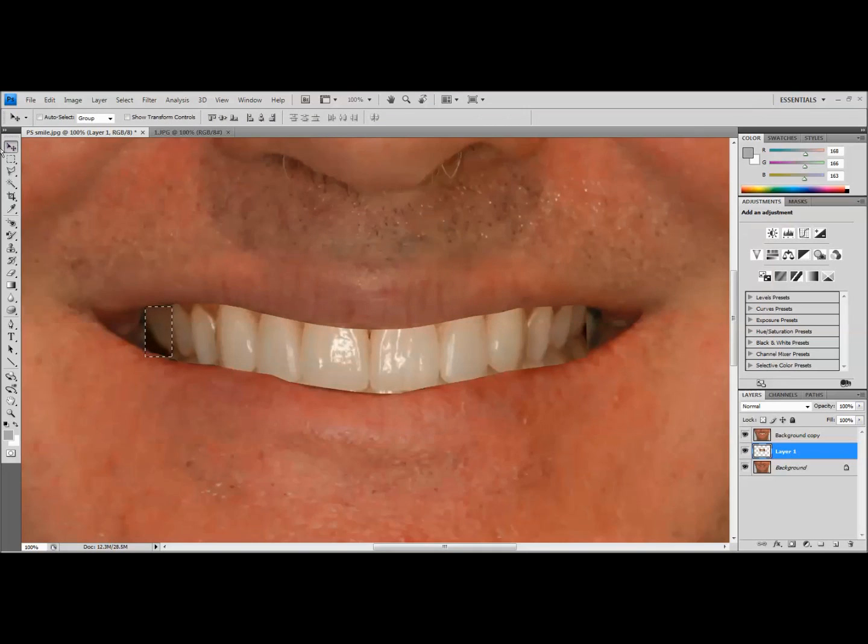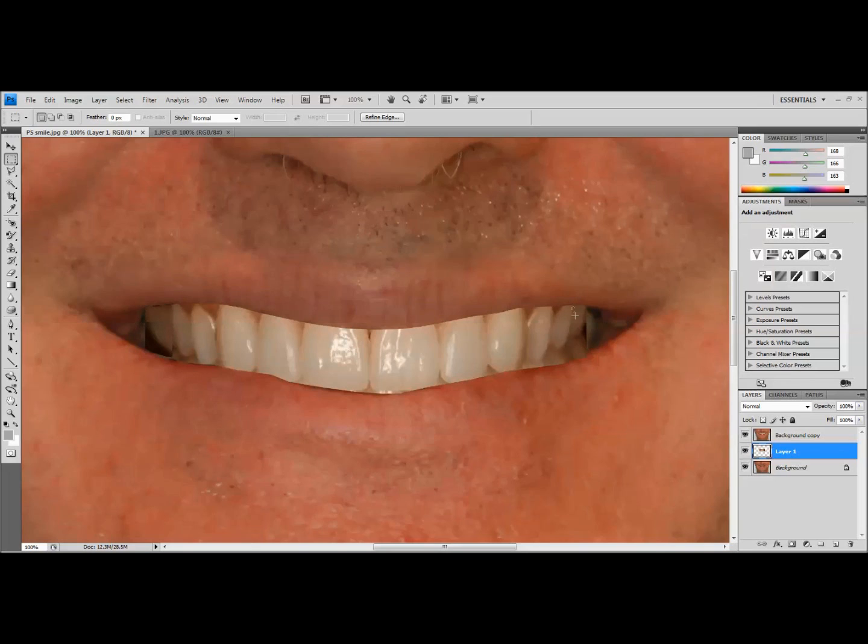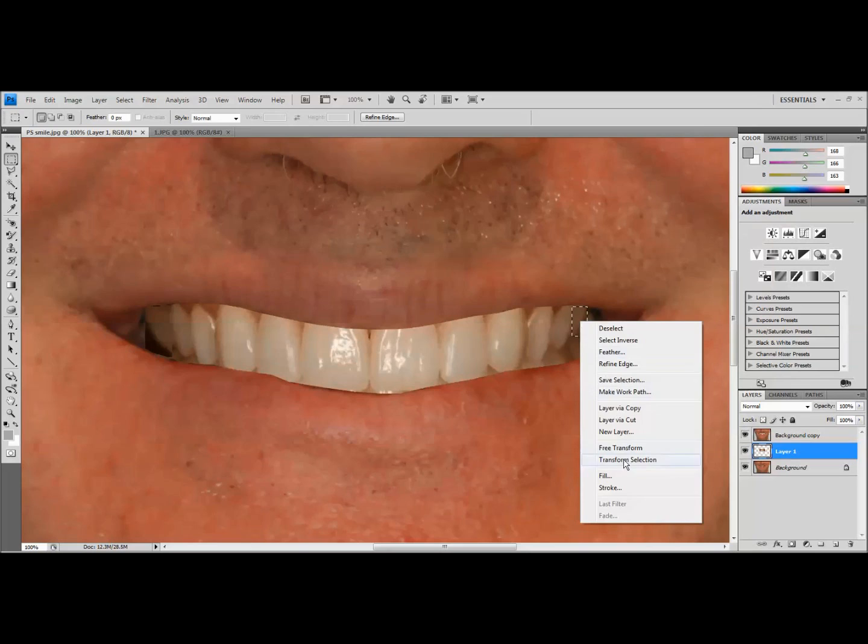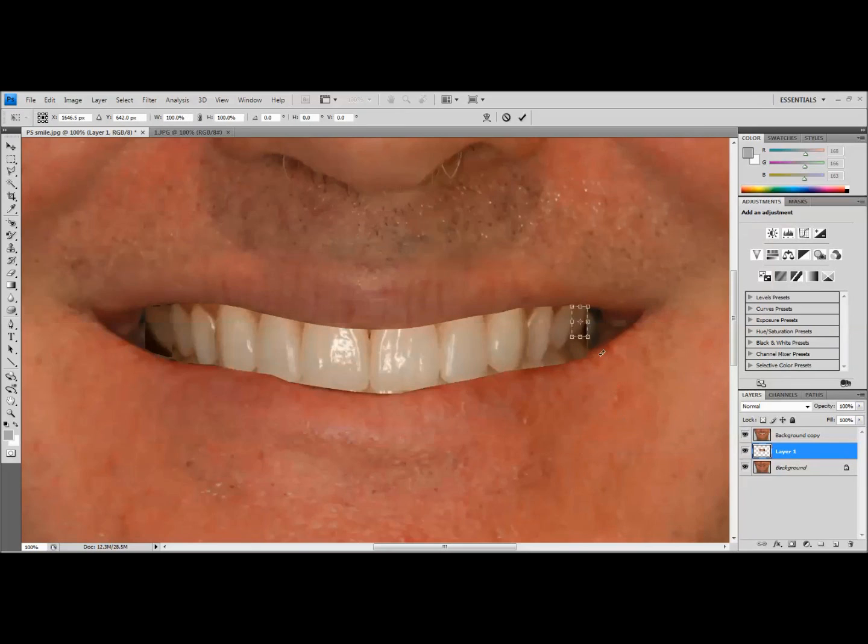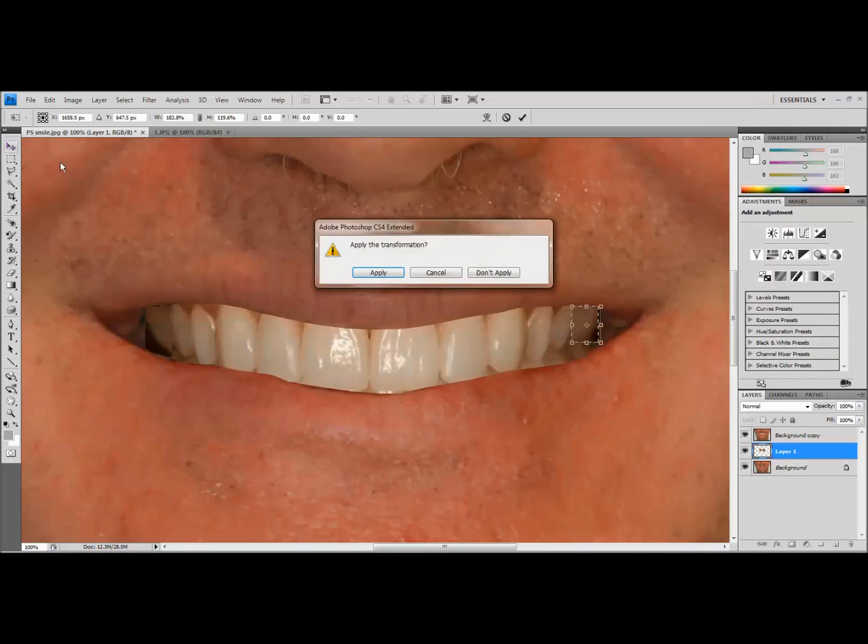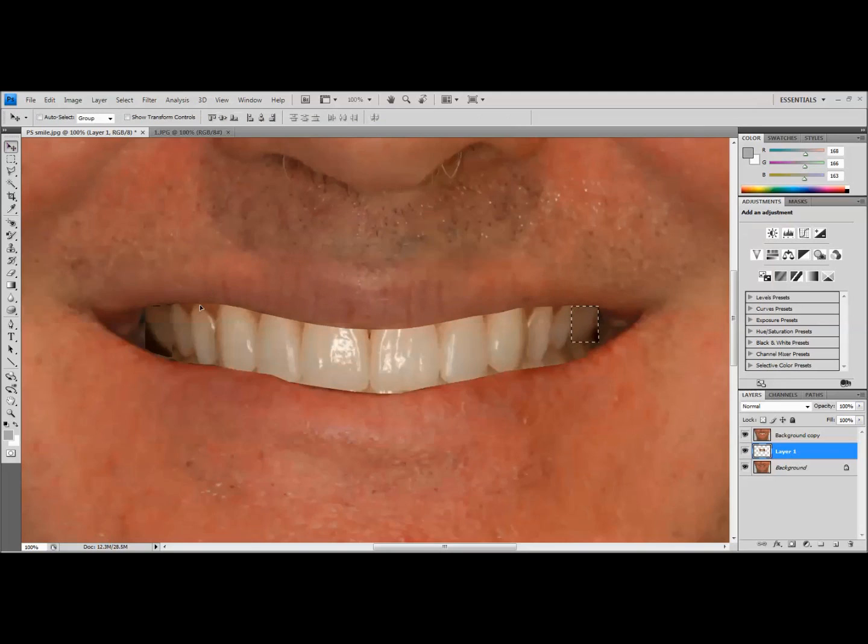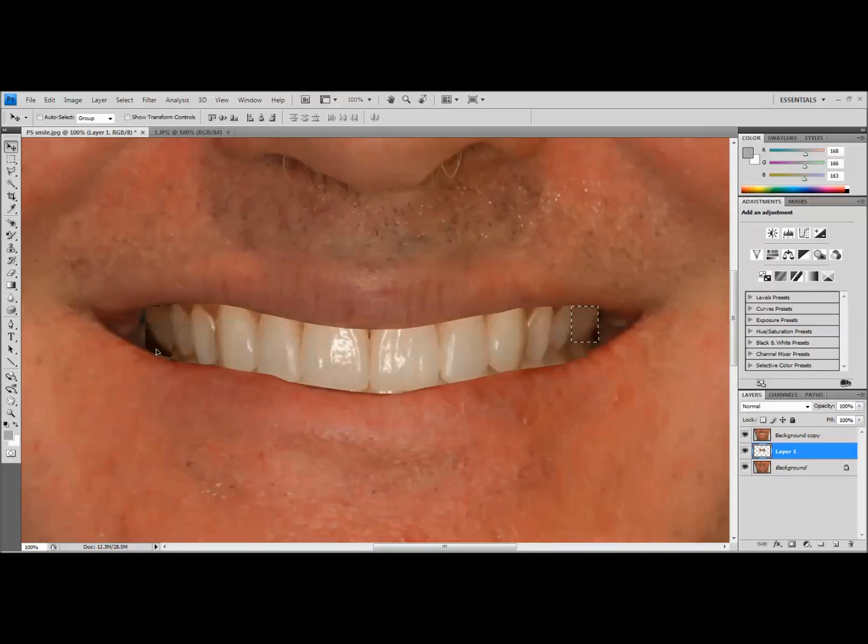Now I'm going to come over and do the exact same thing with this first molar. We're just going to grab it with the marquee tool, right click, free transform. And I can widen that out and fill in the buccal corridor. So we're looking much better on our width. Now the only thing that I'm not liking is how this looks a little rough and it's obviously been altered.